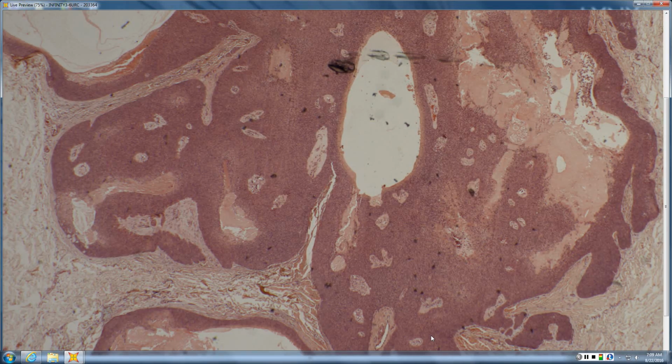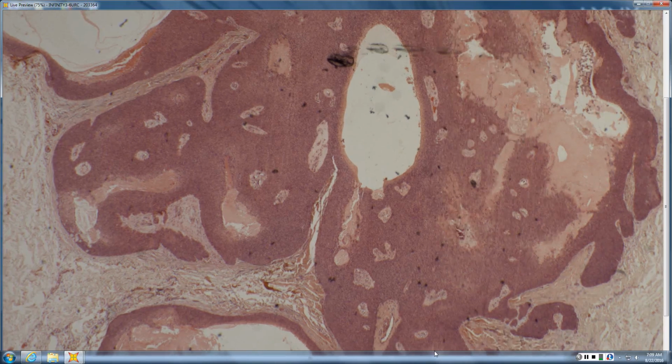Those nodular hydradenomas can have cystic change, like this one. If it's very large, lots of cystic change, you can call it a solid and cystic hydradenoma. If all you see are what looks pretty classic for hydradenoma, poroid-looking cells, but they're all within the dermis, and there's just these little round tumors in the dermis, it's a dermal duct tumor. So they're all really kind of the same things. It's just sort of the overall pattern and how you get to that naming. Very frustrating. I'm just the messenger, don't hate me.